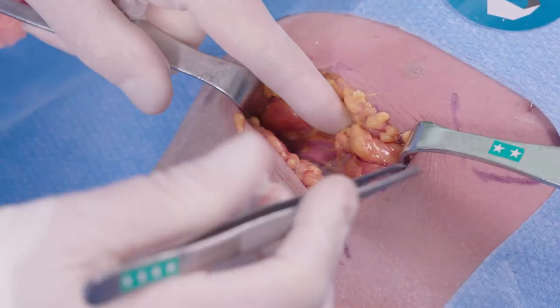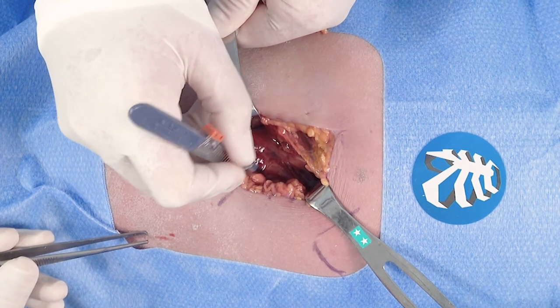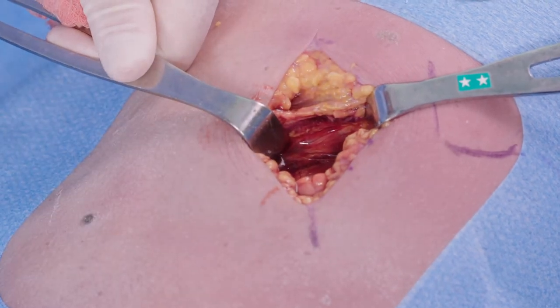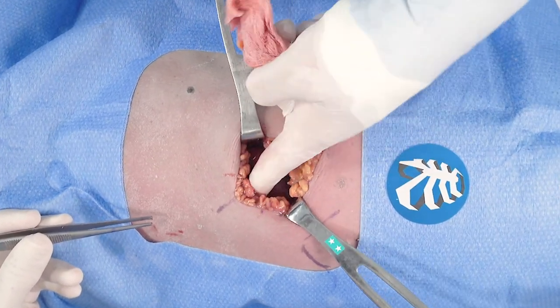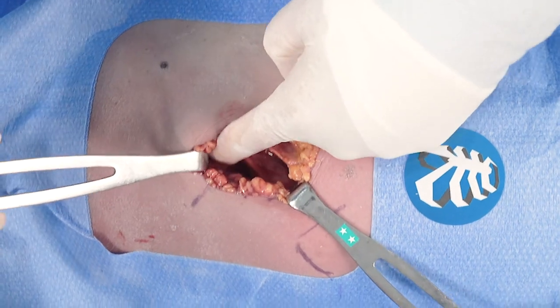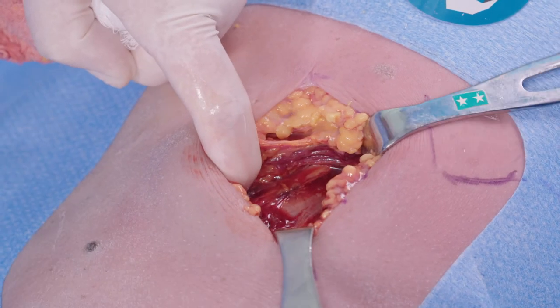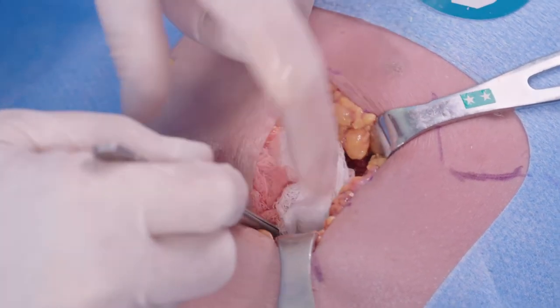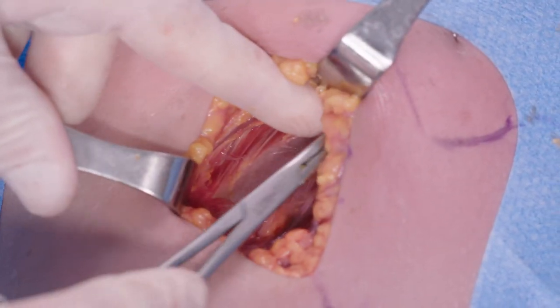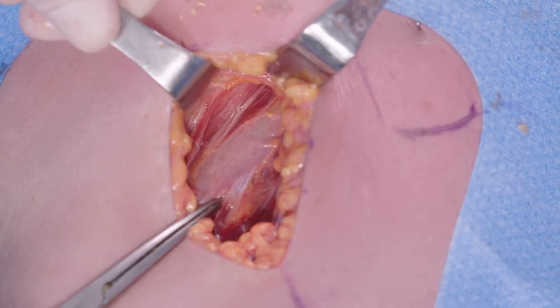Here I see the fibers of the latissimus dorsi muscle, so I'm going to take these fibers along their direction — splitting and sparing the muscles, not cutting them. Once there, there is a plane that you can develop by simply using blunt dissection that is avascular in this location. I am essentially right on the chest wall. Now that we've come through the muscle and we're in the submuscular plane, we're going to identify our ribs — you can see very clearly this is probably the sixth rib right here in the middle of the incision.